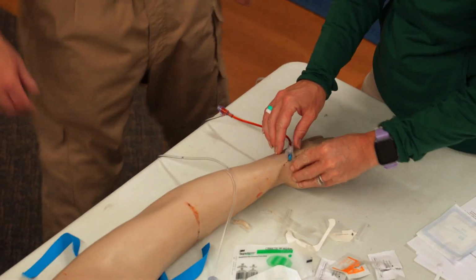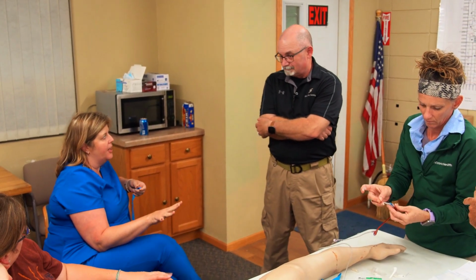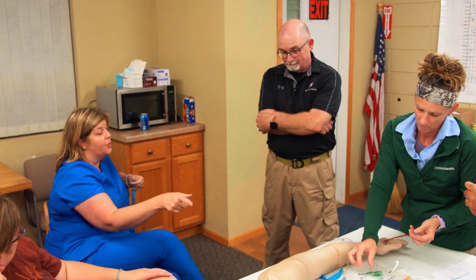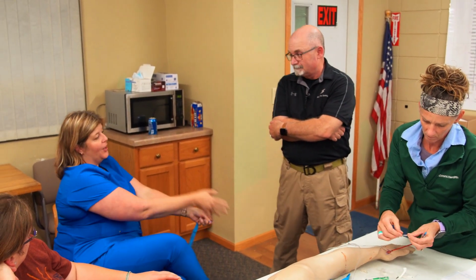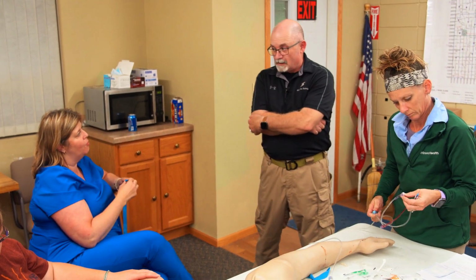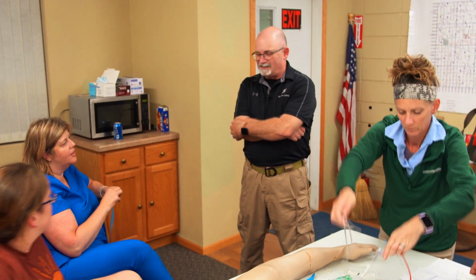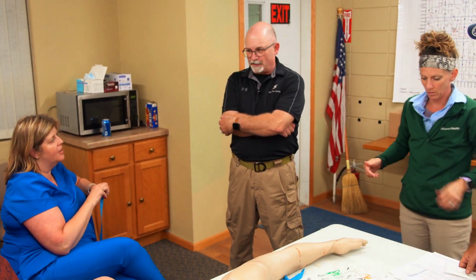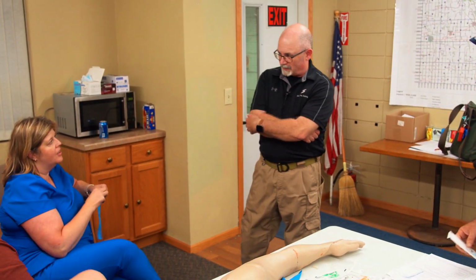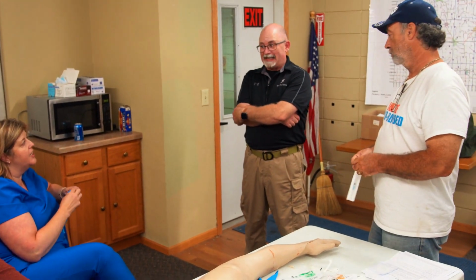All right. Theoretically, we're not cutting off shirts and doing stuff like that, but when we're starting an IV and we're now connected to all of this, are you disrobing somebody before? So there again, you got me. I'm a little low on my sugar. You're not entirely sure my pump's working right. I'm going to give him an IV because I think we might need to.